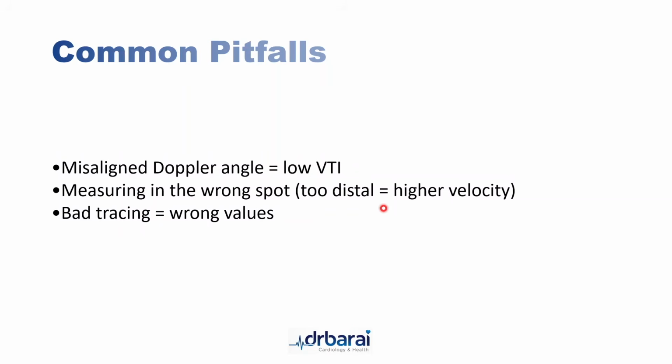So you need to be super cool in finger painting, finger tracing. Most of us use the left index finger to do the finger tracing. Some people use the right finger. I don't care whether using right hand or left hand. As long as the tracing is good, it will give you the good value.